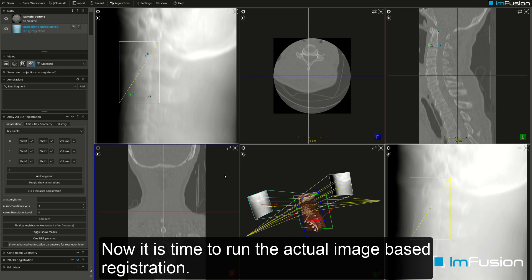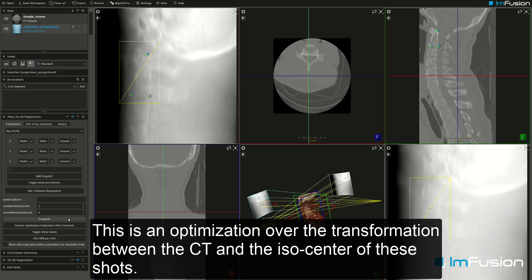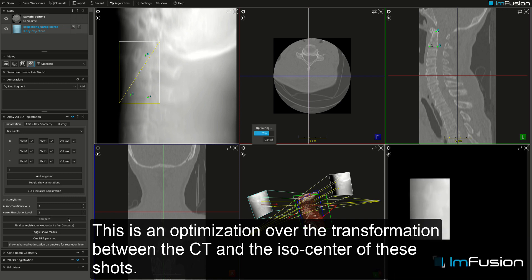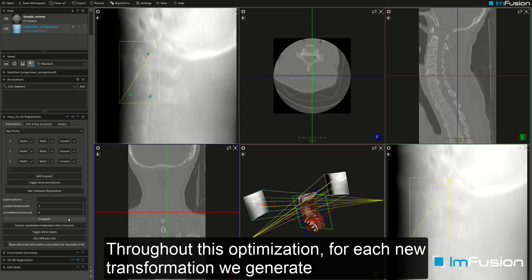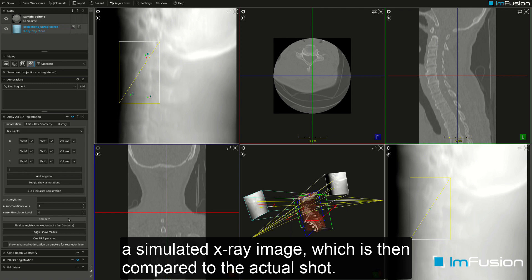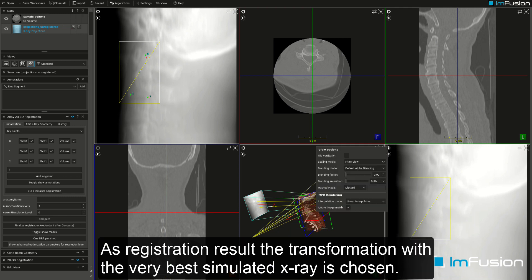Now it is time to run the actual image-based registration. This is an optimization over the transformation between the CT and the isocenter of the shots. Throughout this optimization, for each new transformation we generate a simulated x-ray image which is then compared to the actual shot.